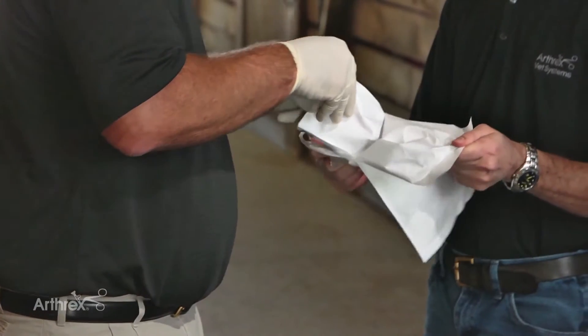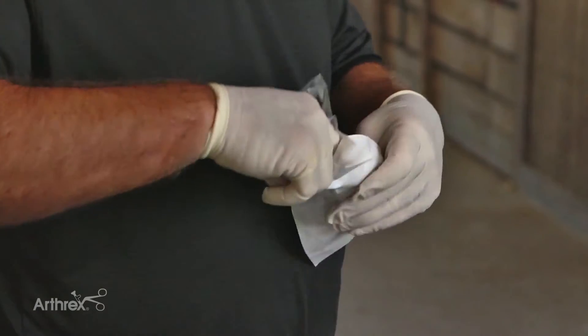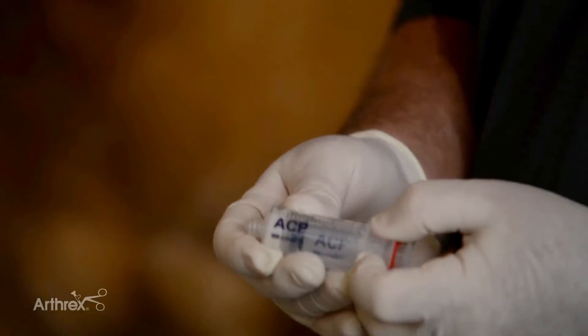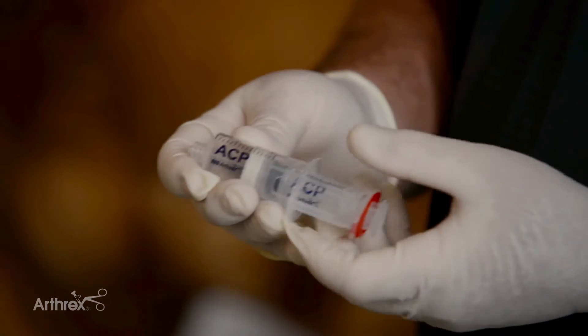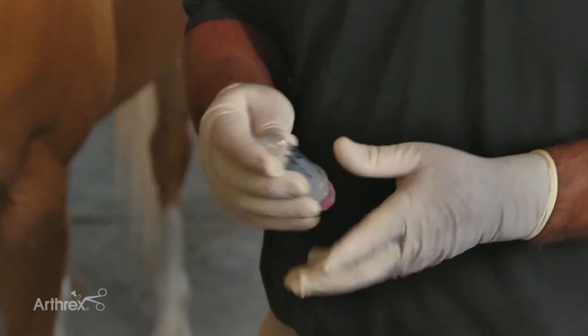This is how the ACP kit is marketed — it's double sterile. We go ahead and get our sterile syringe. There are two parts to the syringe: the outer and the inner. The outer harvests the blood; the inner will eventually harvest the plasma.